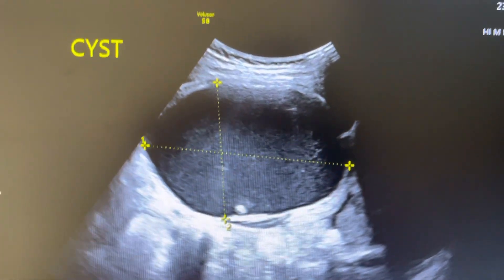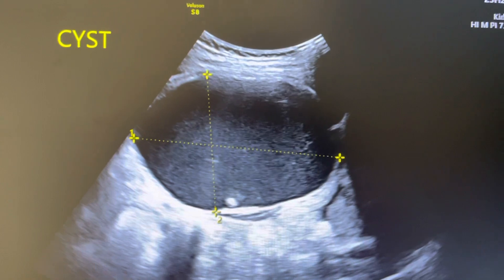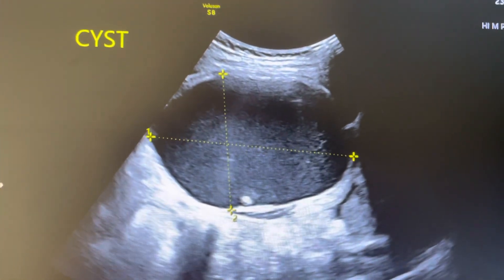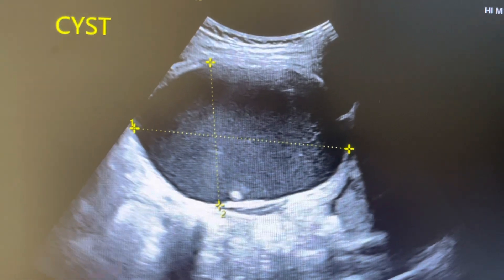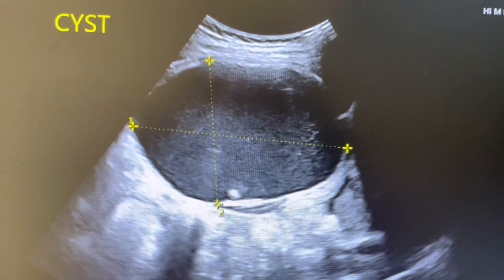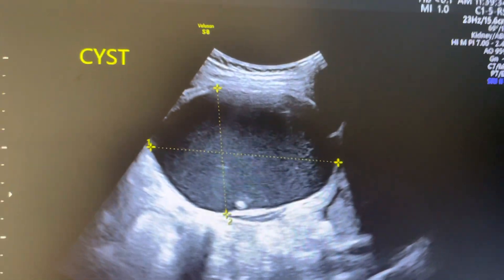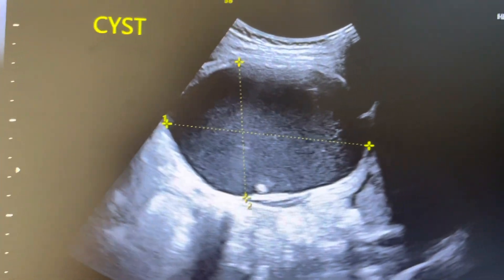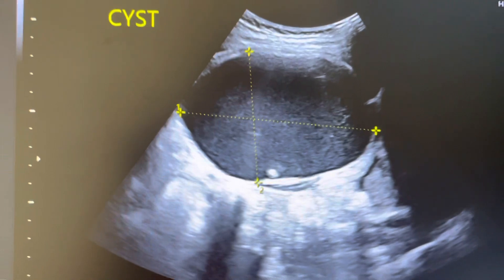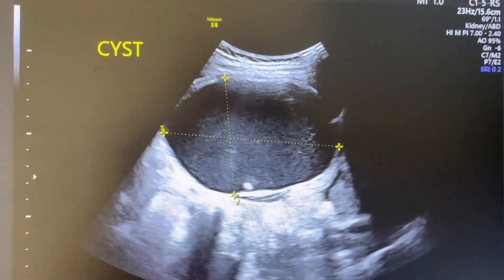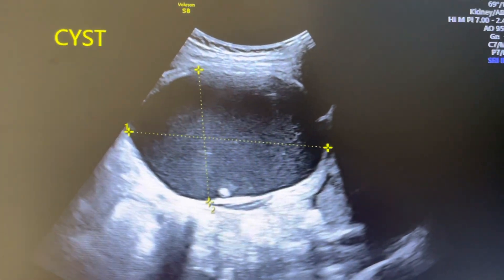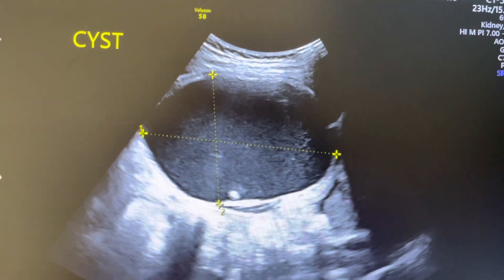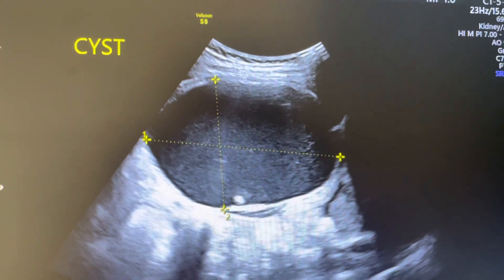This is a very interesting finding — whenever we see internal echoes inside a cyst, we often assume it is an endometriotic cyst. Yes, homogeneous low-level internal echoes are a sign of endometriotic cyst, but the texture here is somewhat different from a true endometriotic cyst.